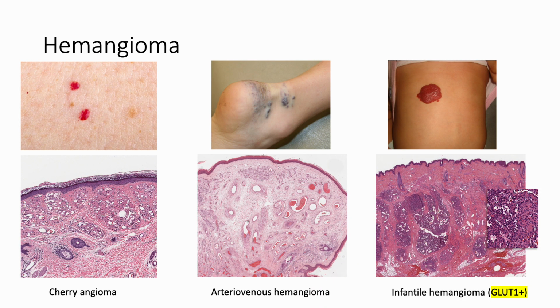Next, I will talk about the hemangiomas very quickly. So this we call cherry hemangioma, which is very common in seniors. If you look at yourself, you may see one or two on your body or extremities, and histologically it only has ectatic vascular channels. And the next one is the AV hemangioma, arteriovenous hemangioma. Some people believe it's just a malformation, and you can see on lower magnification there are larger thick-walled blood vessels along with thin-walled blood vessels, so AV hemangioma.